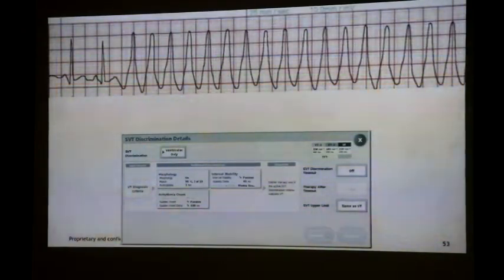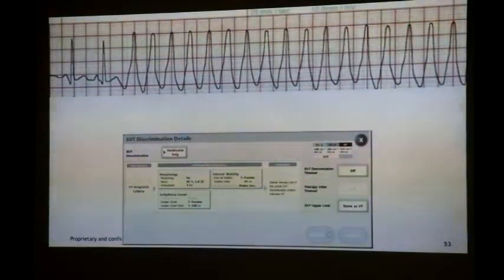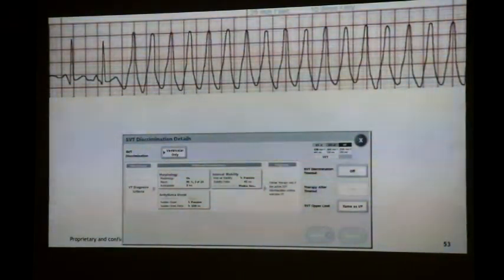We've got to the point where the morphology templates can actually work better. So if you consider sudden onset, sinus tachycardia, it differentiates between VT and sinus tach. AVRT comes in once, VT comes in once.